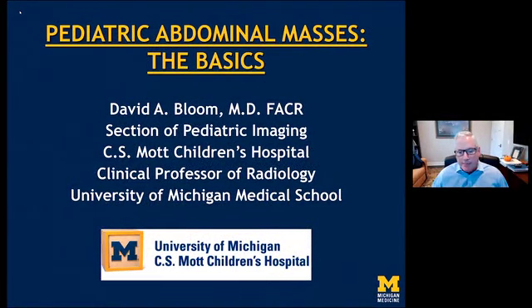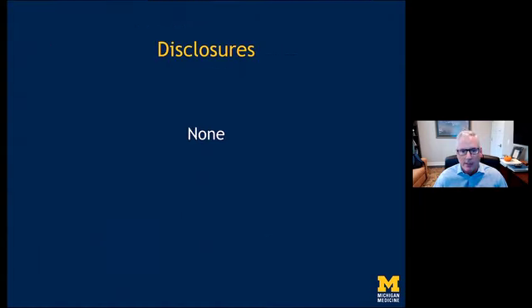And obviously, there is so much that we could cover in 1 hour. I've sort of found a couple of important topics to try and review, as well as to really hone in on some of the ways to think about abdominal mass imaging, especially with regards to the use of MRI in pediatric patients. I do not have any disclosures.